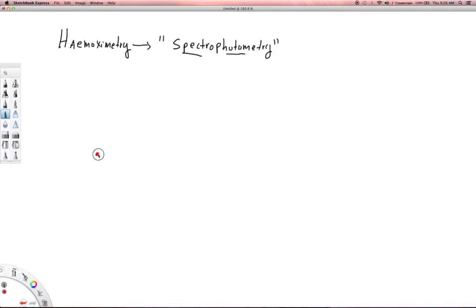We'll use the good old Bohr model of the atom. You have your positively charged proton, and then in very discrete energy levels around the nucleus of the atom, you have electrons, which are negatively charged, and they're attracted to the protons through the Coulombic force. We actually know that they exist in a cloud of probability density, but I'll draw that as an orbit to simplify the model for the high-yield understanding.